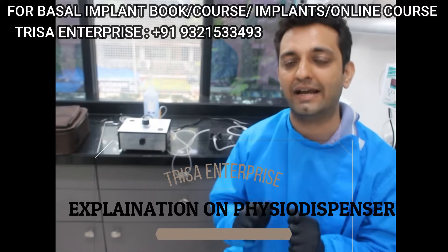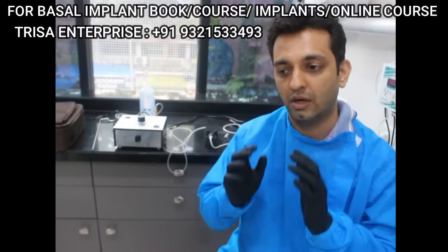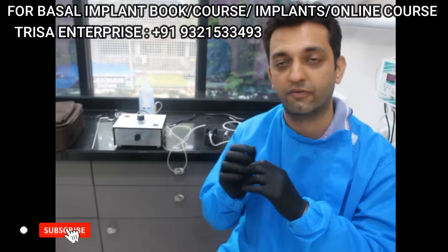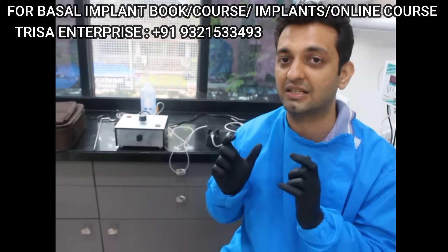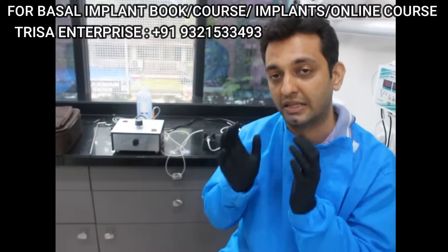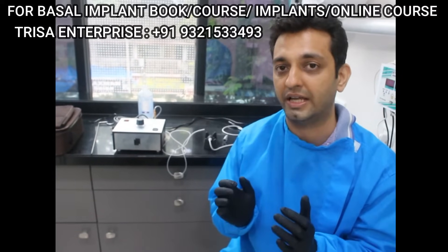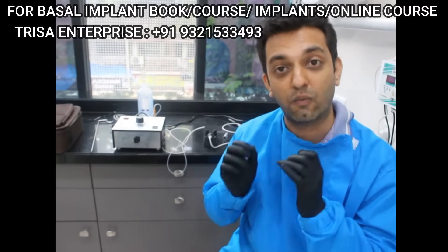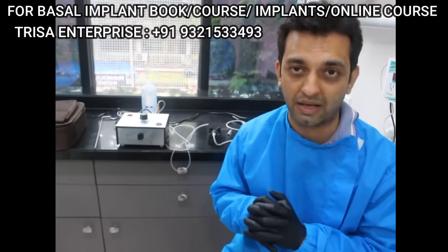Trisa Enterprise has come up with one of the most needed and most amazing products — the physio dispenser. I have used the WNH, the Coxo physio dispenser, and physio dispensers from almost all companies. The heart of the physio dispenser is its motor. I have traveled across countries and found that one of the best motors comes from Korea. We have shipped that motor to India and created this Make in India physio dispenser at half the price of a Coxo and one-third the price of a WNH physio dispenser — but it works as good as any other physio dispenser in the market.